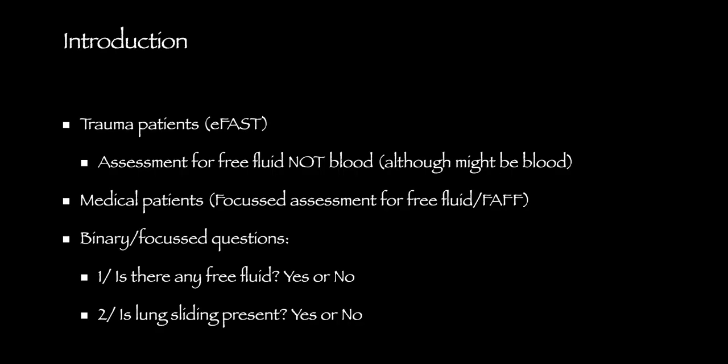So eFAST is used in trauma patients to identify free fluid. It's important to remember that this isn't necessarily blood, although in trauma you're probably going to assume that it is blood. It's very similar to Focused Assessment for Free Fluid, or FAF, that's used in medical patients.